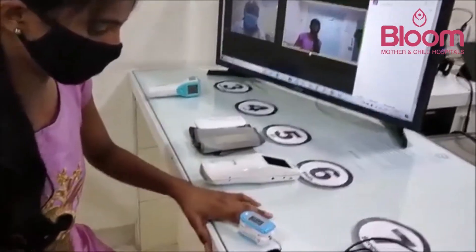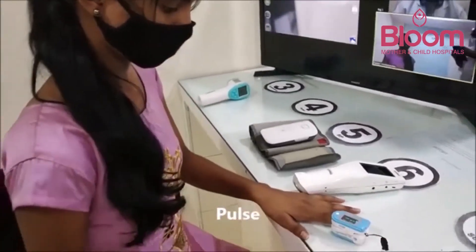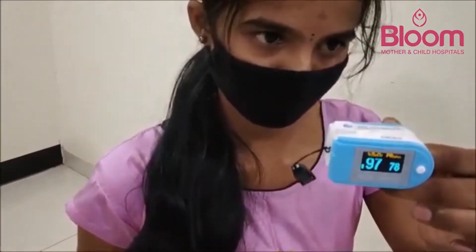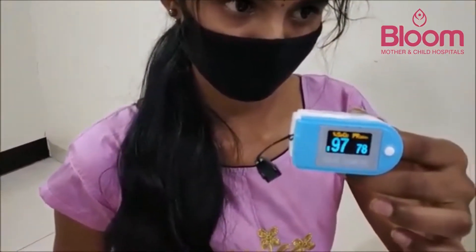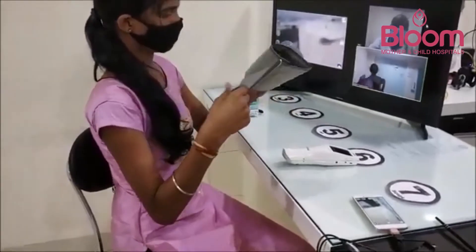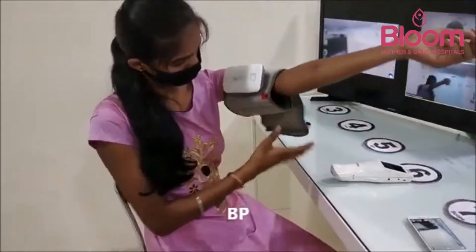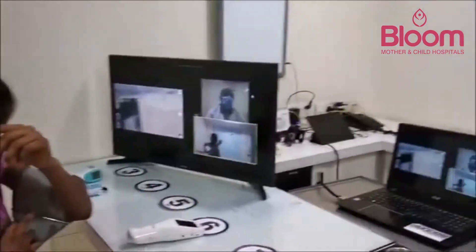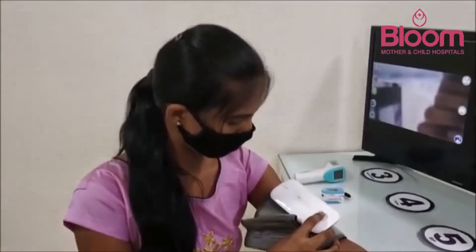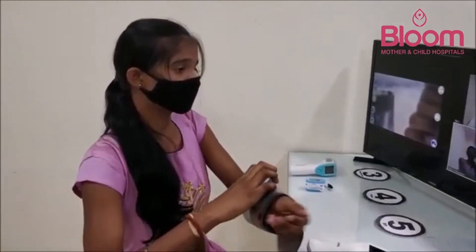The patient is now taking their pulse rate using the pulse oximeter. The oxygen saturation reads 97%, and the pulse rate is 78. The patient then moves to the BP apparatus on the left hand side. The blood pressure reading is 110 by 70.